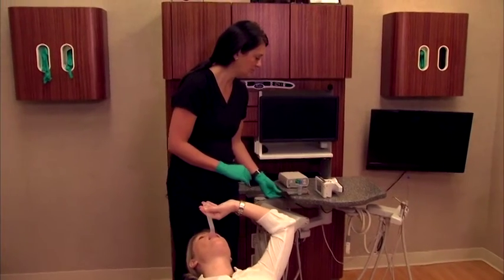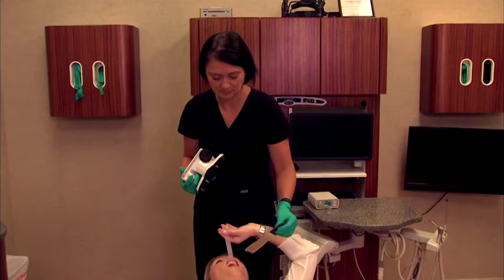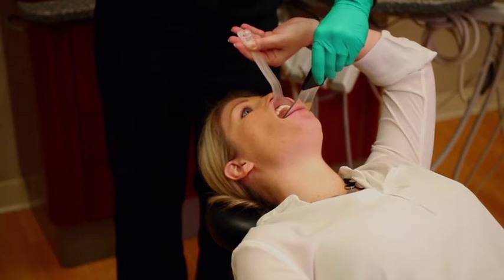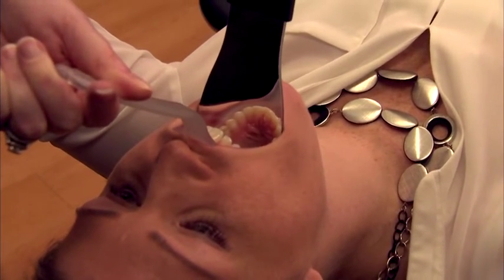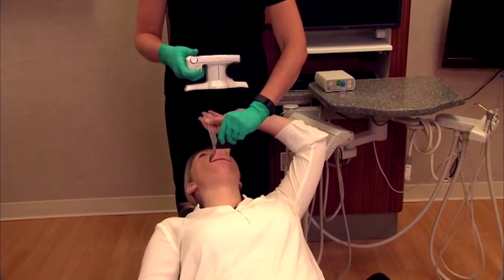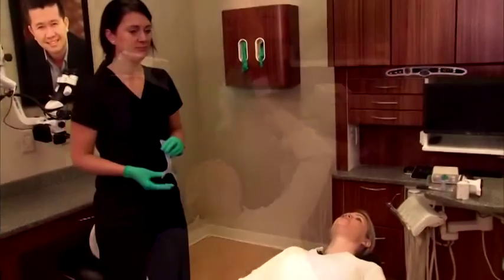If you're using metal retractors or smaller retractors, the patient will sometimes inadvertently pull the lips into the picture. The key when taking this picture is to get the mirror in place and essentially lay it against the lower occlusal plane. Notice Kristen has not pulled the camera up yet because she's looking to make sure she can see what she wants to see in the mirror. Once she's done that, it's simply a matter of getting the camera in place, seeing what you want to see, and exposing the picture. If you do that, you're going to take really good consistent mirror shots every time.